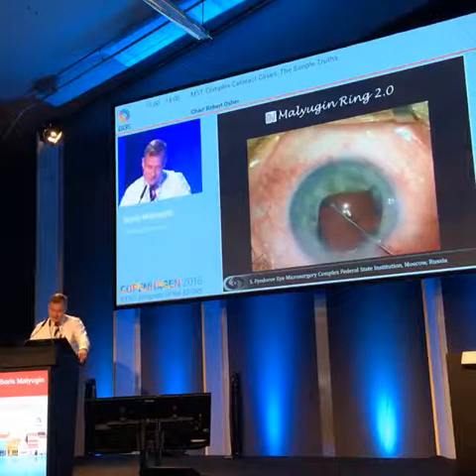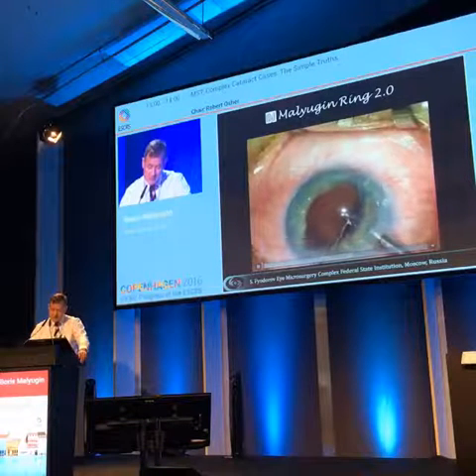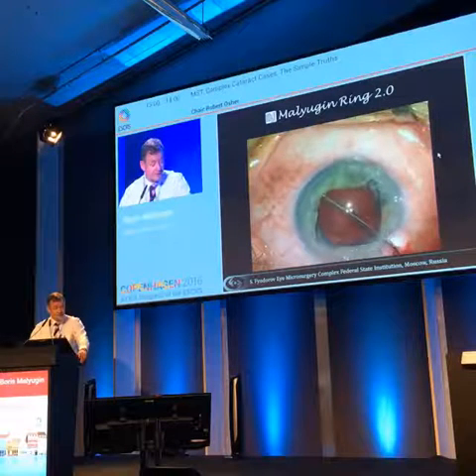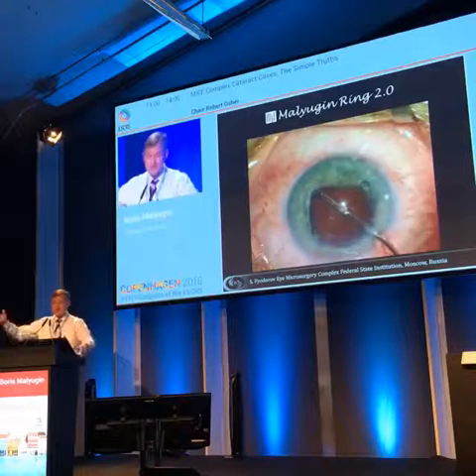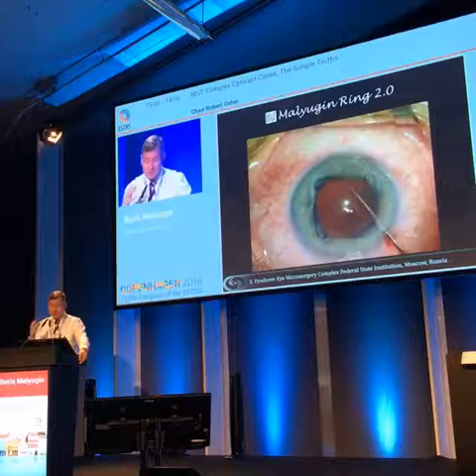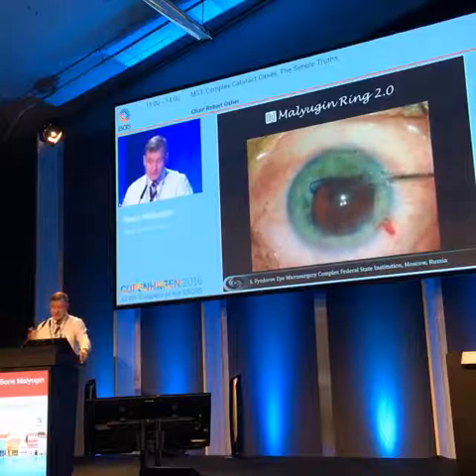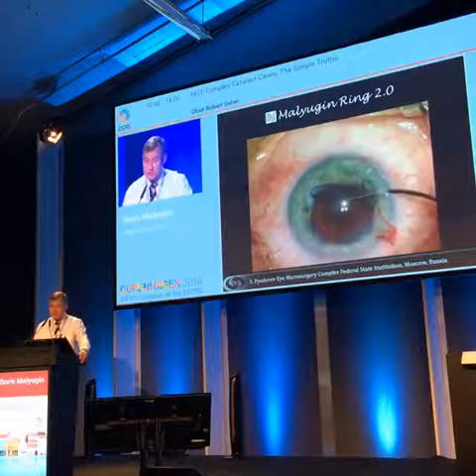And as you can see here, this was an interesting step of this procedure. After injecting the ring, this scroll disappeared, and I was pretty much sure that it was dislocated. But look at that area, it was perfectly in place. This was the fold of the iris going over the scroll and showing how biomechanically unstable this iris is. So then, as soon as the ring was in place, the rest of the procedure was more or less routine.